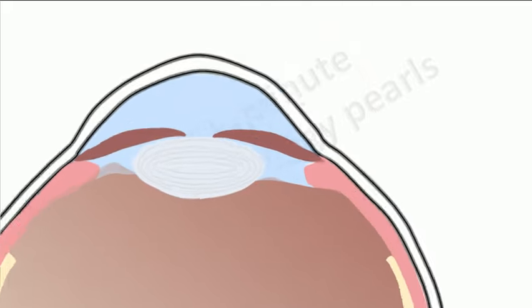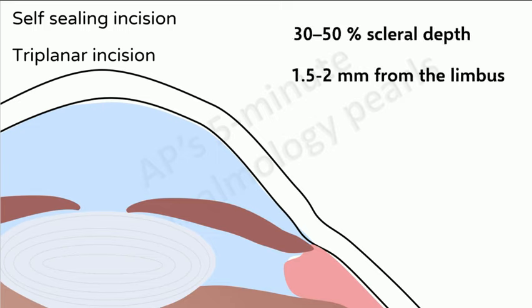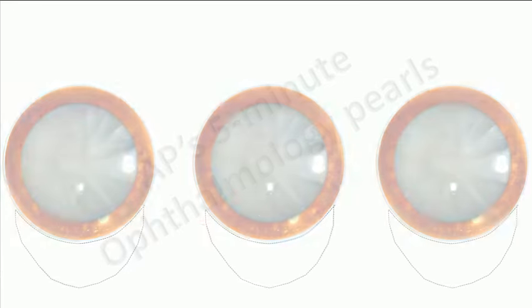The scleral incision is a triplanar incision, which is a self-sealing incision. Therefore, this is a sutureless surgery. The first plane of the triplanar incision is made at 30 to 50% of scleral depth, 1.5 to 2 mm from the limbus. The second plane is the scleral tunnel, which is carried forward about 1.5 mm into clear cornea, and the third plane is the plane of entry into the anterior chamber.